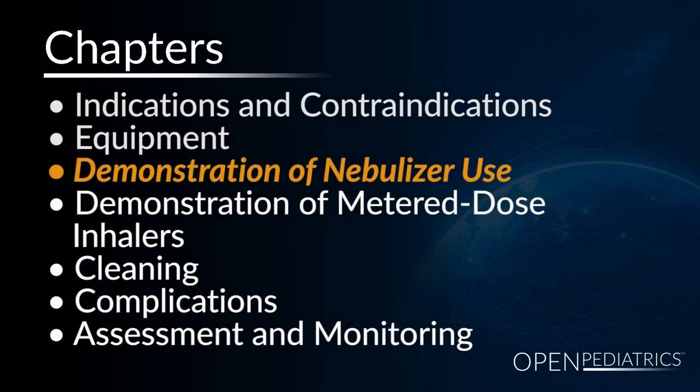Demonstration of nebulizer use. I've double-checked the medication dosage. We looked at the order from the doctor and everything looks appropriate for our child. I've gathered the necessary equipment and I'm going to select the appropriate interface. Let's go over a few options.